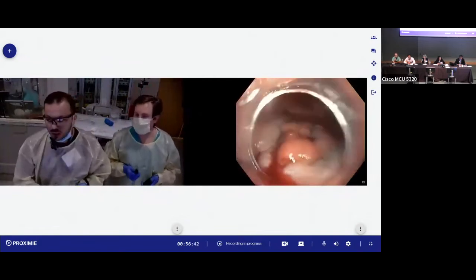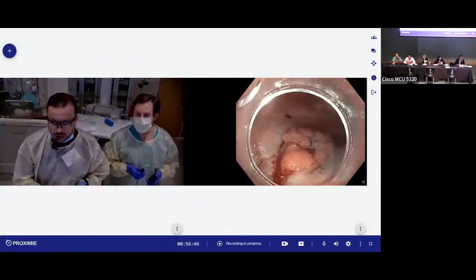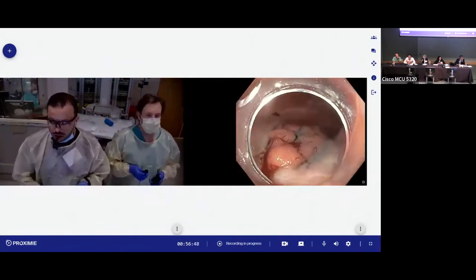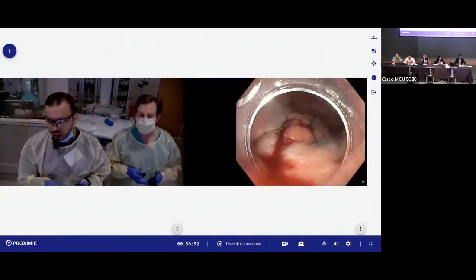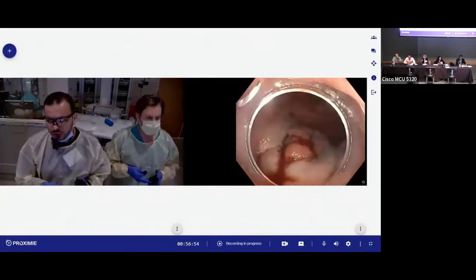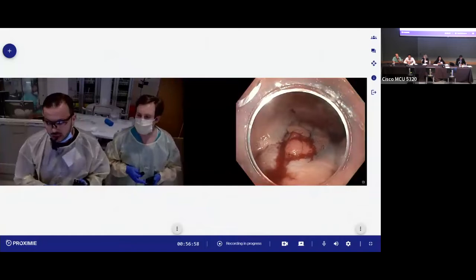Yeah. I think, thank you, Jeff, but I think as Satyan was alluding to, the lift is really important, the technique of the lift. Even in a scarred area like this, we're still able to get some really neat submucosal lift with good technique.